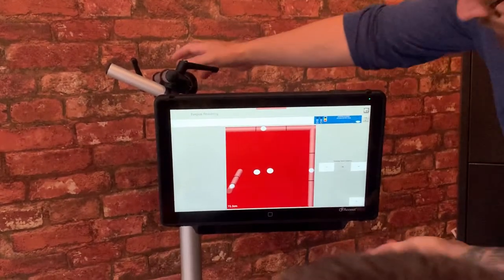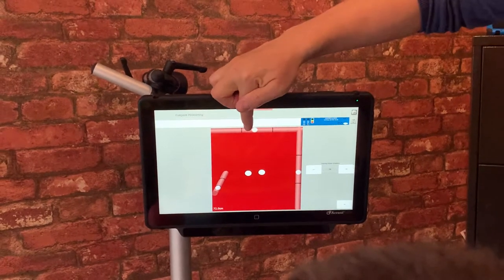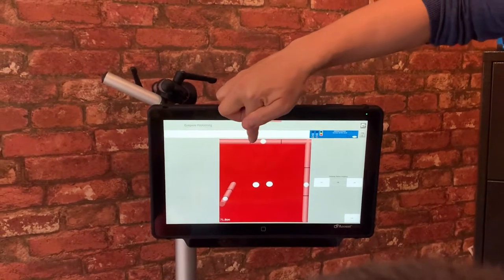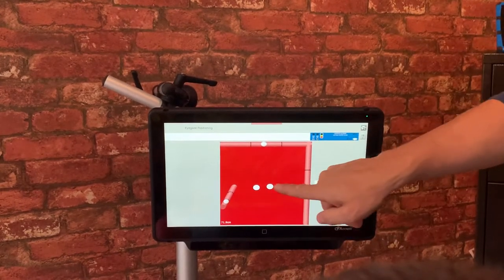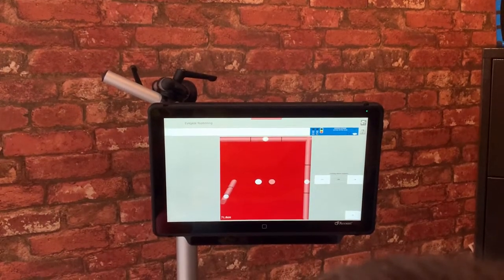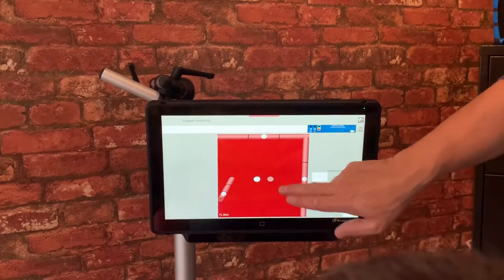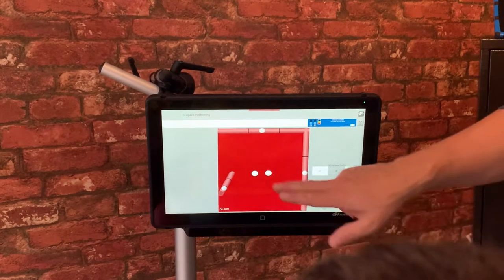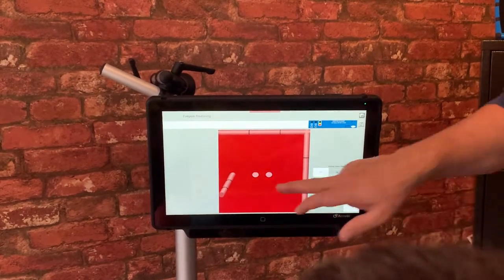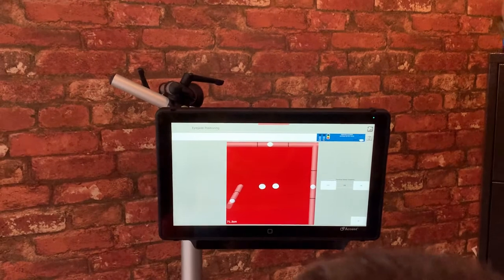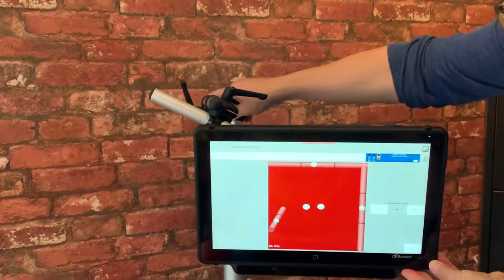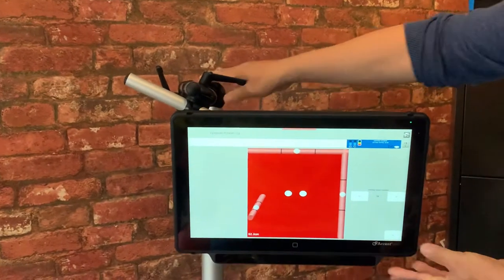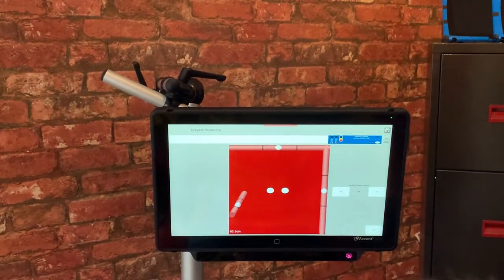The device is not quite ideal although it's almost centre. Now again it can be anywhere between these black lines and this is perfect. You'll see that the eyes are active on screen. If I cover one eye you'll see that it's now going off and if I cover the other you'll see that's going off as well so it's showing both eyes. The distance is a little bit too far so I'm going to bring the device or the client closer to it.